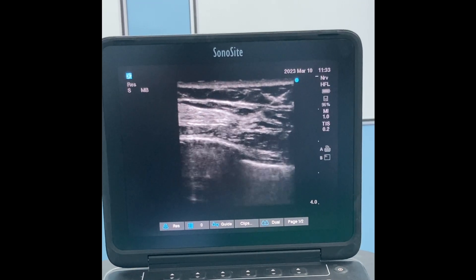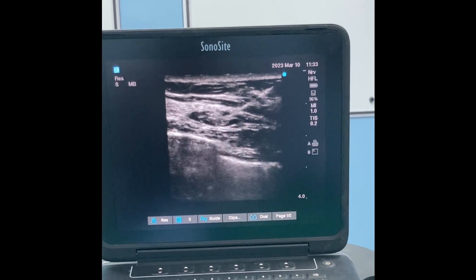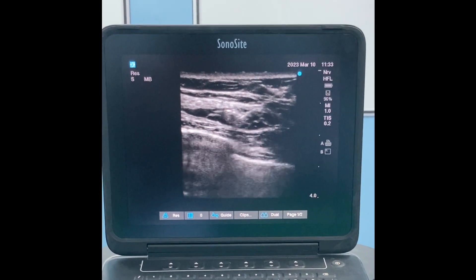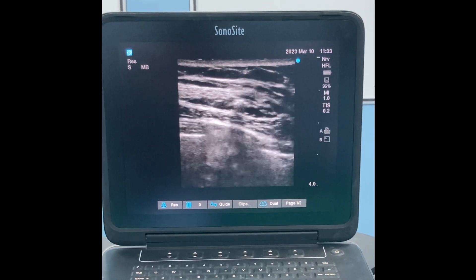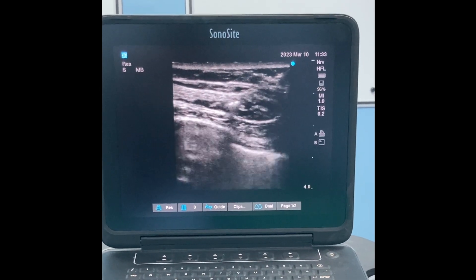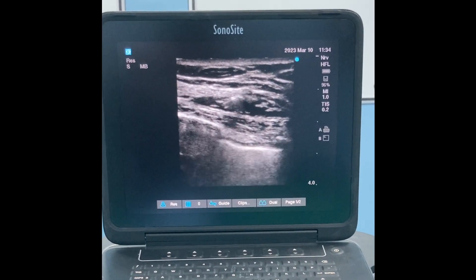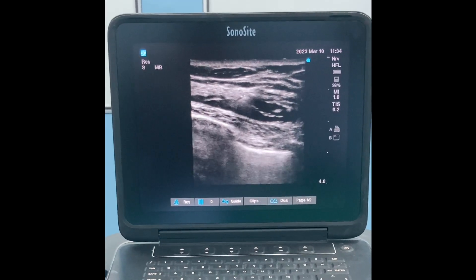Now we are depositing the drug between the latissimus dorsi and serratus anterior muscles. You can see that the latissimus dorsi and serratus anterior muscles are separating from each other as the local anesthetic spreads.